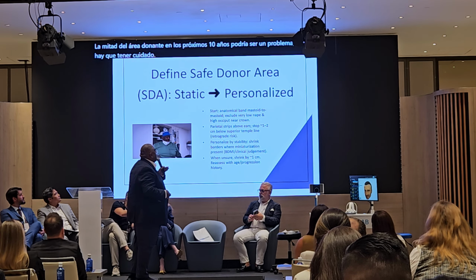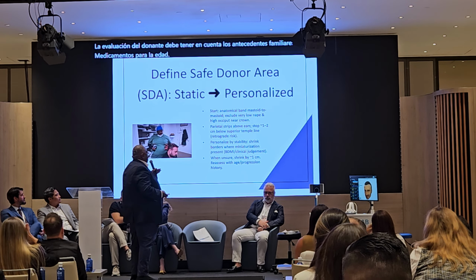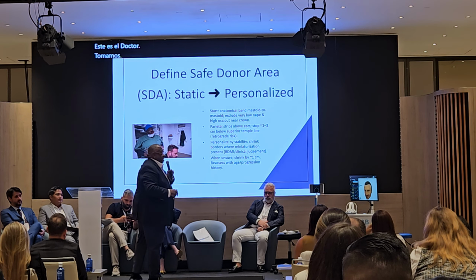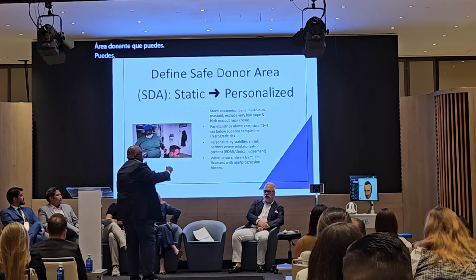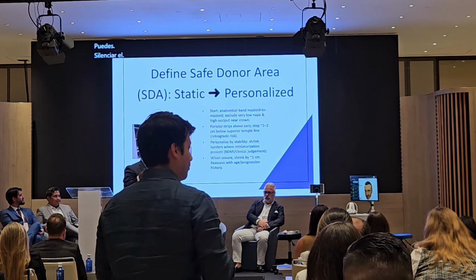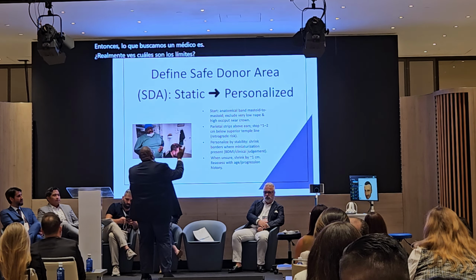So here quickly, it's a small video just to show, this is Dr. Costis. We take the donor area. You can mute the video. Yeah. So what we look for as a doctor is to really see what are the boundaries. That's the first thing. You need to know what are the boundaries, age, so you know where to take the measurement. Quite important.